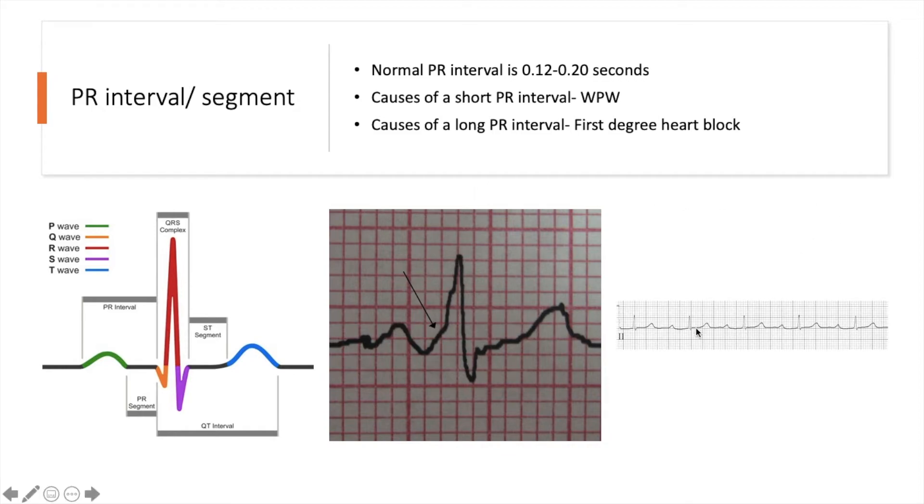On the opposite end of the spectrum, we have a long PR interval. And this is in a condition called first degree heart block. Again, this is just to introduce the topic. But you can see if you start from here and finish here, that's definitely longer, definitely bigger than one large square. So this is abnormal.